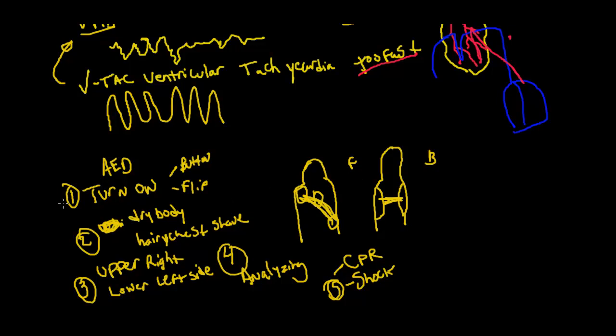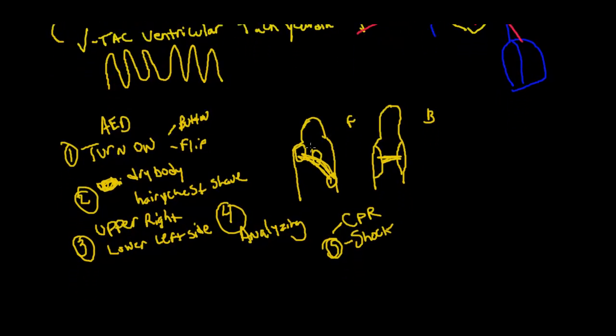So again, one more time, turn it on, prep the body, pad placement, let it analyze, make sure everybody stands clear, and then shock the person if advised, or begin CPR depending on what it says. And you may have to go through these. I've got a great video on this, so if you watch the Bondi video, it's probably one of the best videos. It also shows agonal breathing and how that can be confusing. You might think somebody's breathing when in fact they're not.